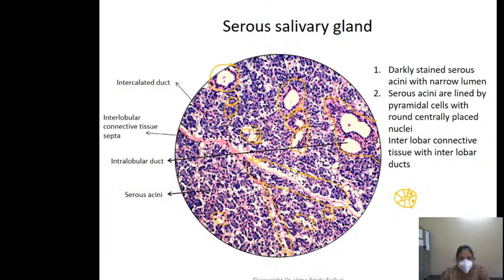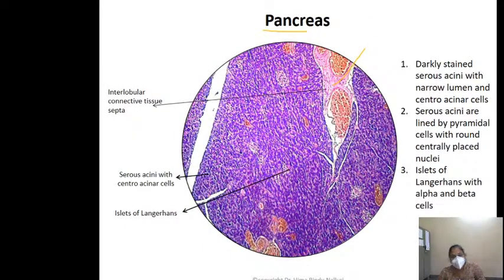Here, this is a small lumen that you can see. But for the acini of the pancreas you don't see the lumen, because in the center of the lumen also you see cells. In the others the acinus continues with a duct like this, but for the pancreas the duct will go a little inside the acinus and then start its duct.